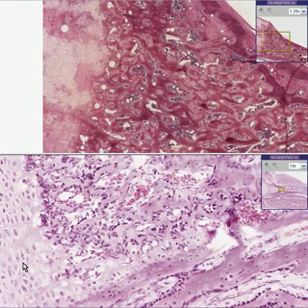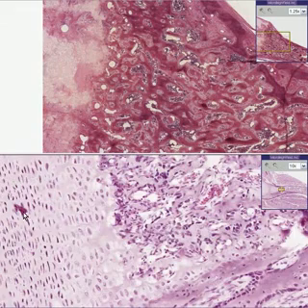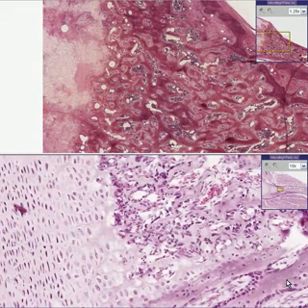If you don't have vitamin D, like in rickets with children or osteomalacia with adults, you cannot have good transition from healthy cartilage, like you see here, into healthy bone, like you see here. Here is such a case of rickets in the upper field. This is in a human. Probably doesn't matter whether it's a child or an adult, and quite frankly, I can't tell.